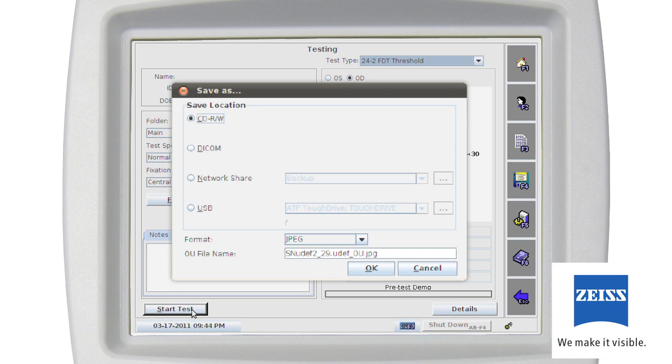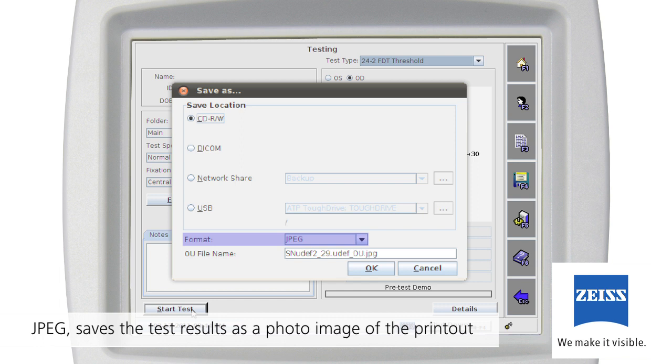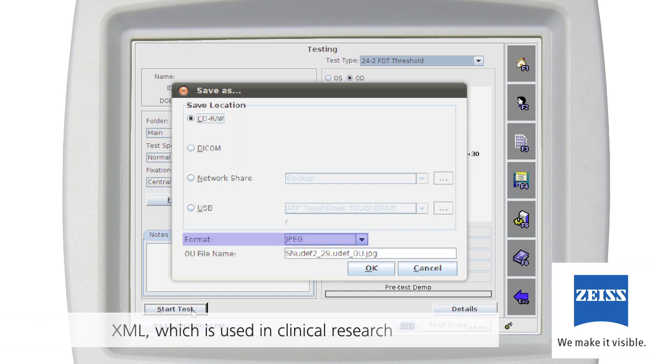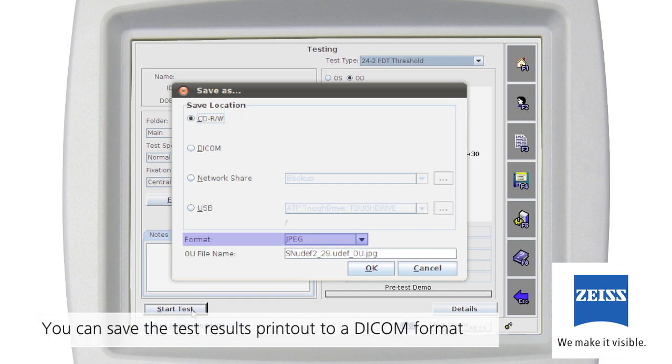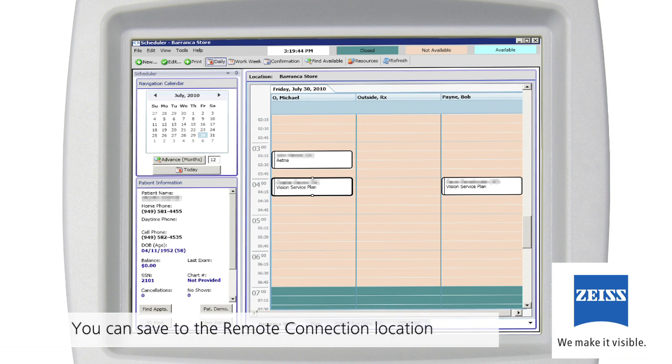You can also save a test to a CD-R/W, USB storage device, or a network share location in any of these formats: JPEG saves the test results as a photo image of the printout in JPEG format; Database backup format FDT2 saves the test in Humphrey Matrix database 8.0 format, which can only be read by a Humphrey Matrix instrument running system software 8.0; XML, which is used in clinical research. If you have enabled DICOM Gateway, you can save the test results printout to a DICOM system in PDF format. If you are using iInfinity's OfficeMate practice management software, you can also save to the remote connection location, which only saves in combined PDF and data format.